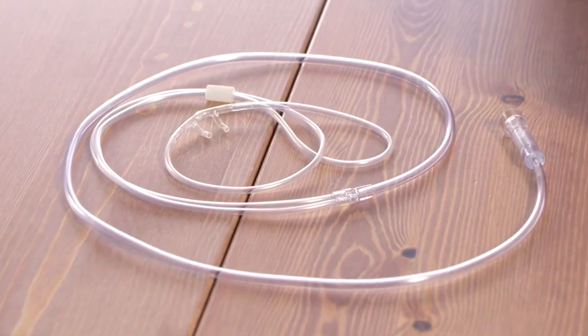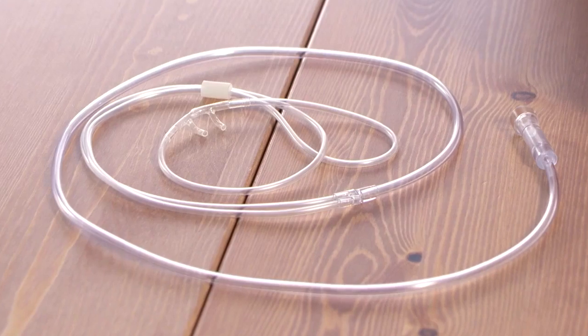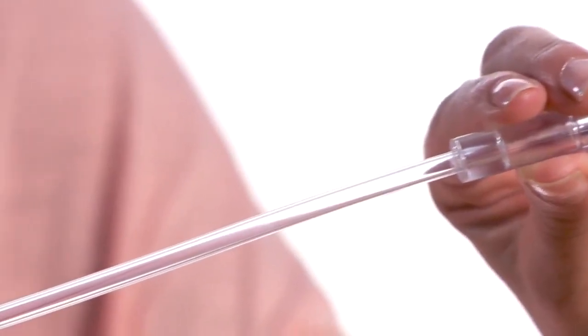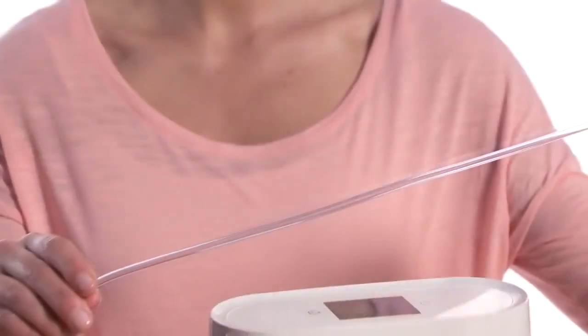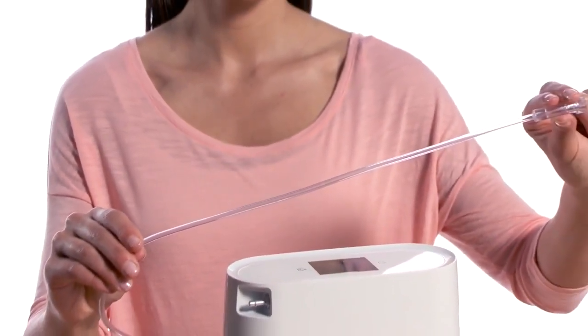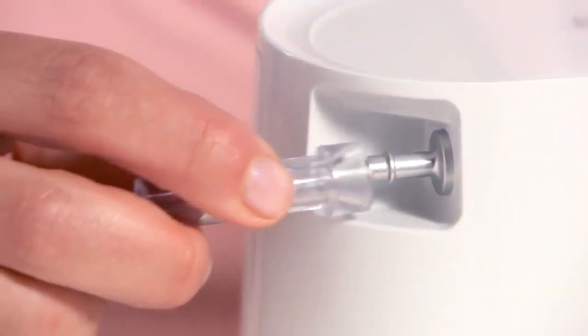SimplyGo Mini is used with a standard single-lumen nasal cannula. The device works with tubing up to 10 feet or 3 meters in length. Avoid pinching or kinking the cannula, as that can disrupt oxygen flow. Firmly connect a nasal cannula to the patient cannula connector.